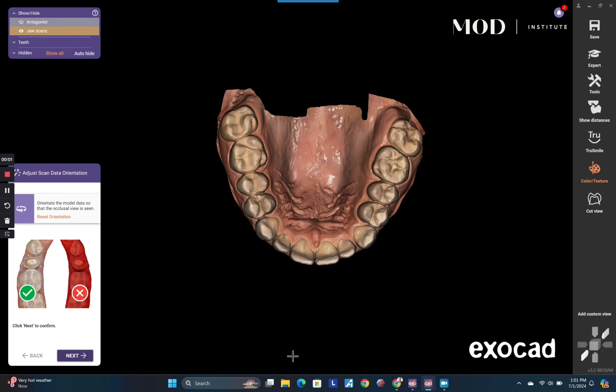Sometimes we get patients that don't want to look like they have different teeth — they want it to look like it's part of them and their personality, and this is the way that you would do that.